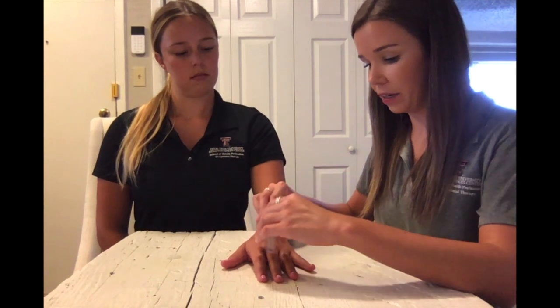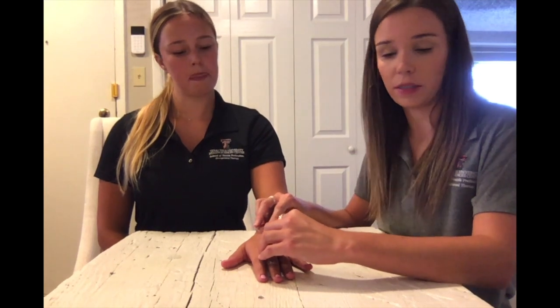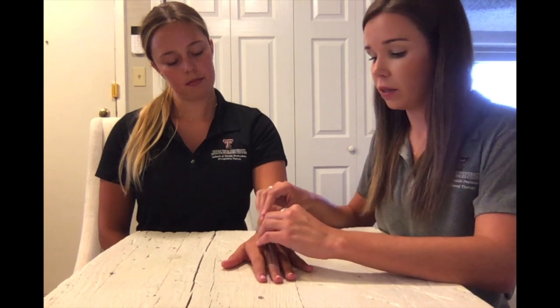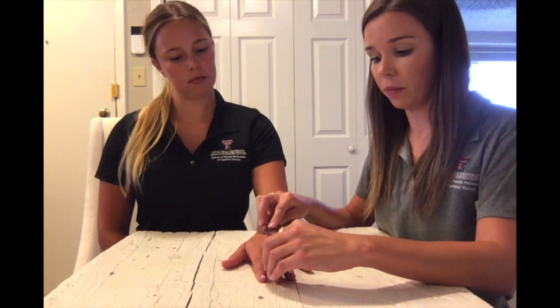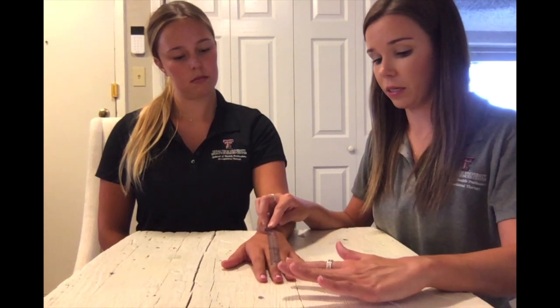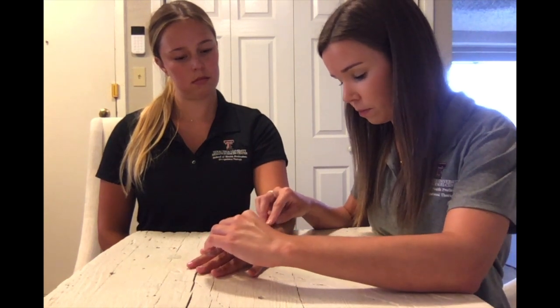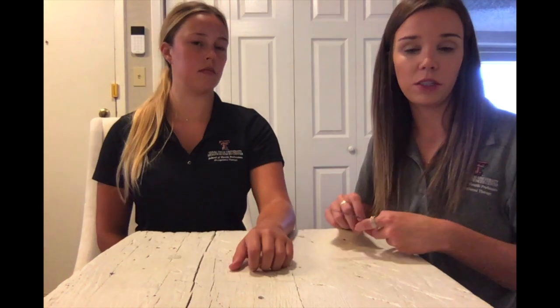Position back to neutral. We're going to place the goniometer in the same position with the axis at the base of the third metacarpal, the stationary arm parallel with the forearm, and the moving arm parallel with the third metacarpal. Now, Addison, I'd like you to tilt your wrist to the left for radial deviation. Addison has about 22 degrees of radial deviation. The norm for this movement is approximately 20 degrees.